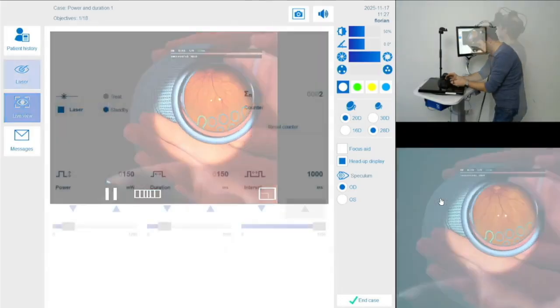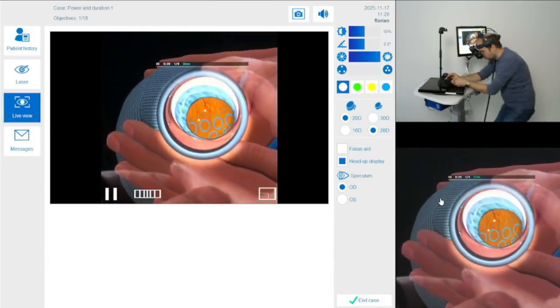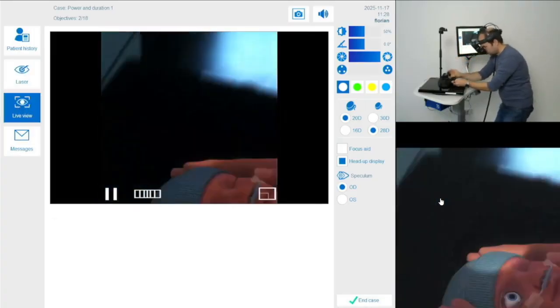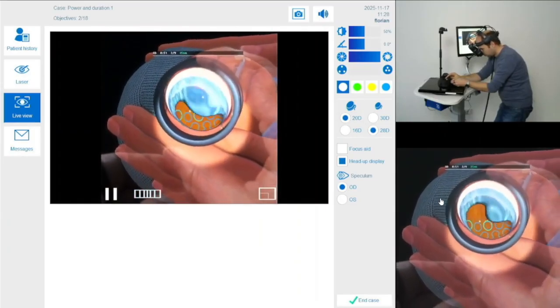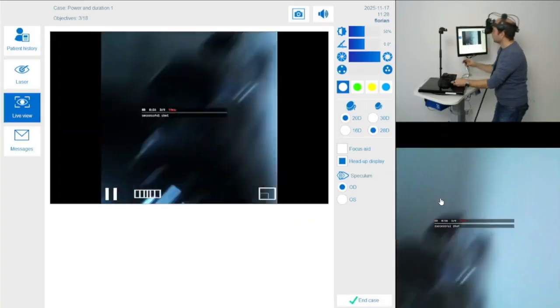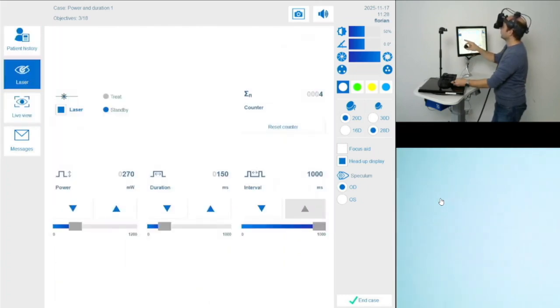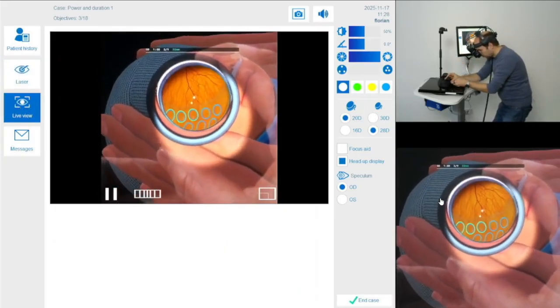So this is obviously not enough energy. I increase the milliwatts, the power. I shoot the second target. Still almost nothing to see. Let's crank it up even more. No, still nothing. I checked that it should go up to 500, so I increased it even more.